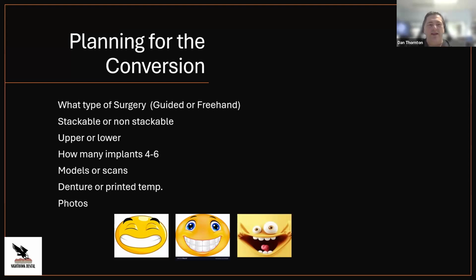Now, with the planning on the surgery, like I said, you'll actually know if you're going to do 4 implants or 6 implants, but things can change when you're at surgery. Sometimes there could be a 5th implant and you left the 6th one out, or you put 6 in, one's not stable enough to load, so a 7th implant goes in that can actually handle the conversion.